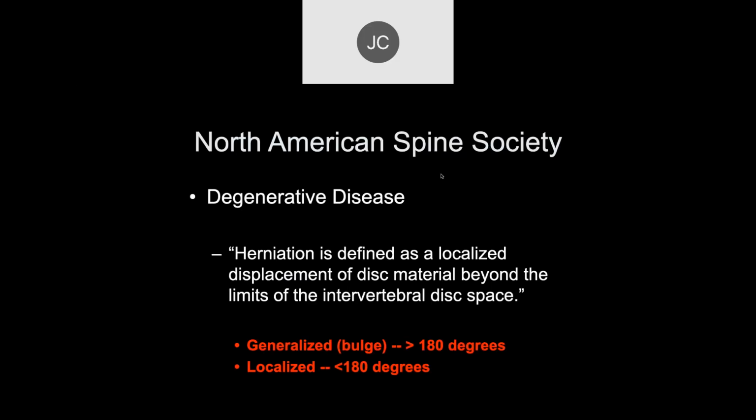Okay, so let's talk about the nomenclature that's recommended for disc herniation. So if we consider herniation, which it's hard for me to say, because for years and years, Mike Modic and Michael Bransowski and I would give lectures where we recommended patients not use the term herniation. But now that the North American Spine Society came out with this, I consider it the standard, though still, many places around the country, many academic centers do not use a standard nomenclature. And that leads still to a lot of confusion in MRI interpretation.